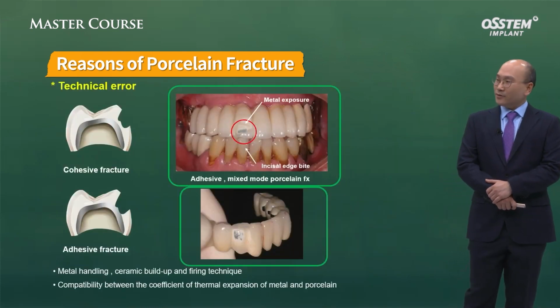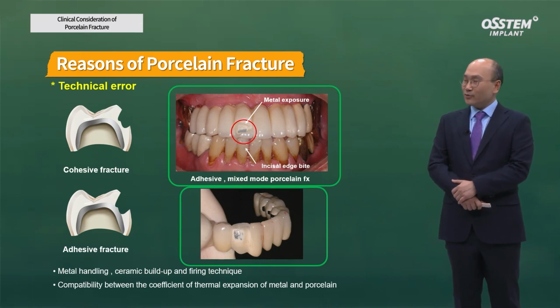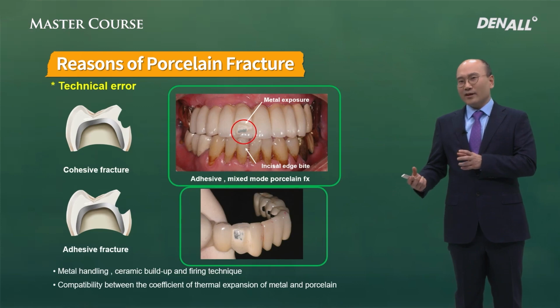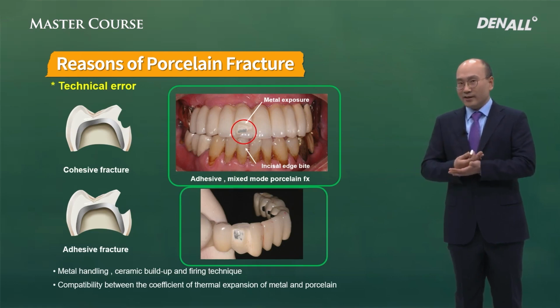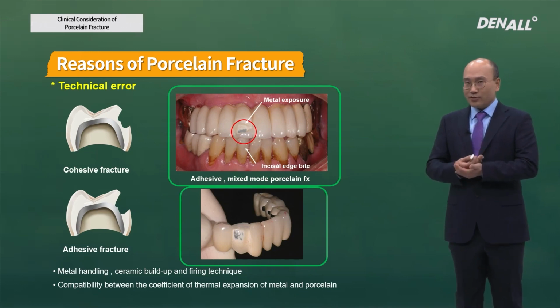The first reason is technical error, such as fracture due to a bubble, and these are issues you don't know about when it's delivered. If a bubble is not visible, you just deliver it, and the patient might come back quickly to your clinic, and you could see there was a problem at the technical level. So dentists need to do a good job, but your technicians and your labs also need to have good quality control.